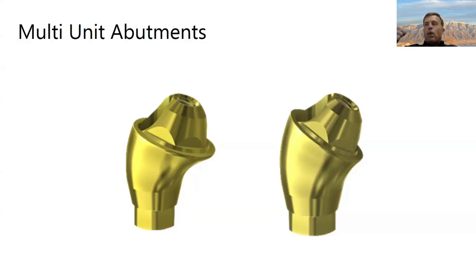The other thing is that we tend to get better long-term results if the tissue around the implant is undisturbed. And an MUA facilitates that because essentially this becomes the platform. We torque this to place on the day of surgery and we never move it. So it allows, depending on what you think about muco-integration, at worst, a tissue to sit next to this MUA and form a pretty good seal. And at best, the tissue might actually attach to it and give you just an extra layer of protection for your implant. So you're going to tend to get better implant health as well.